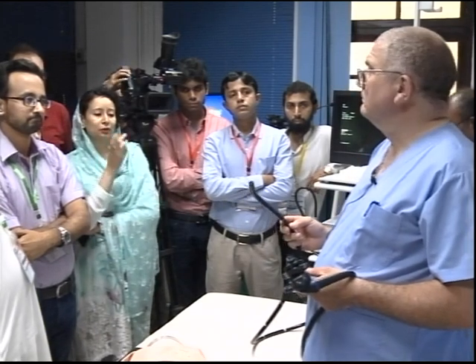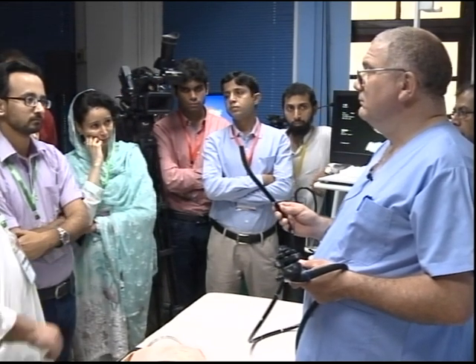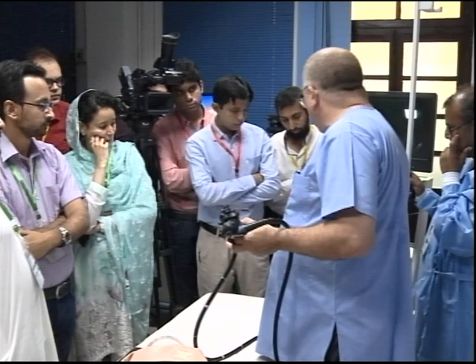The channel might be blocked and insufflation. But there's water coming out, it can't be blocked. Insufflation is not working, right? Water bottle is not... But there's water coming out, so it's nothing to do with the water bottle. The pump actually pumps air into this. The little pipe allows the water to come up.